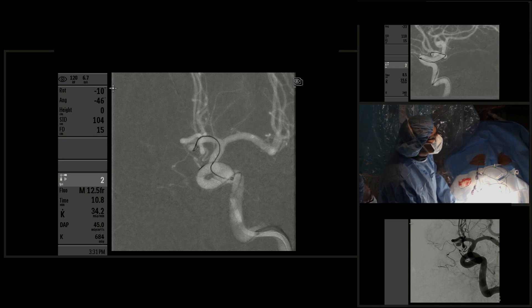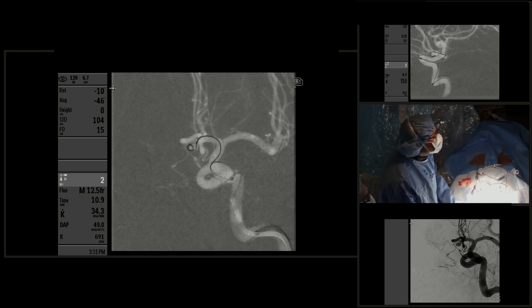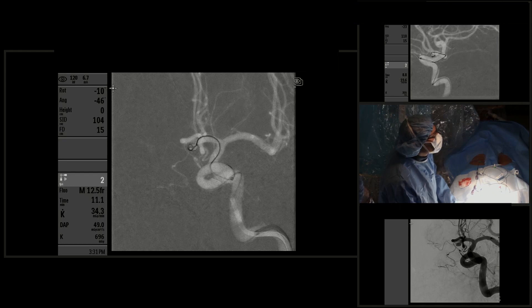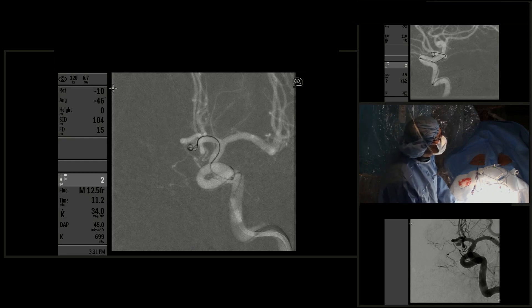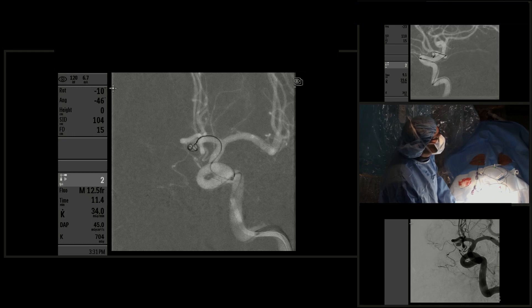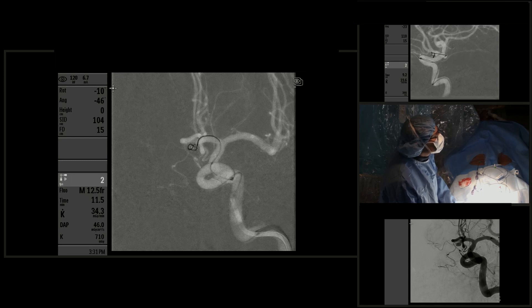The sizing of the coil is key — we don't want to rupture the aneurysm if oversized, and if the coil is oversized or undersized it can potentially protrude into the parent artery. It's important to mention the configuration of the anterior communicating complex, in which bilateral A2 segments of the anterior cerebral arteries are coming from the left A1 and the anterior communicating artery. We need to respect the parent artery and not allow any protrusion of a coil that could potentially lead to clot formation and potential emboli.